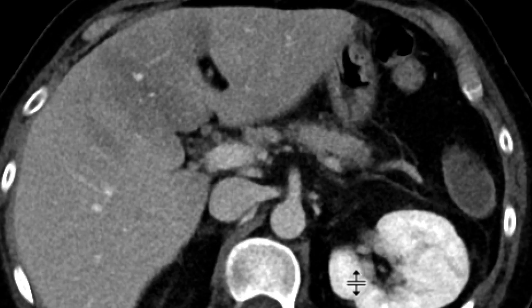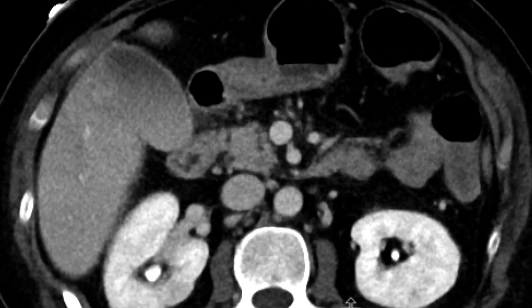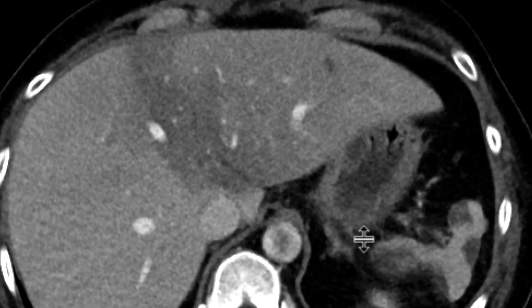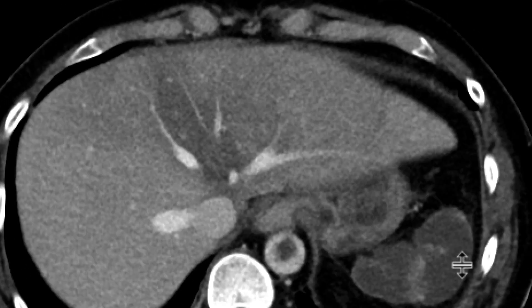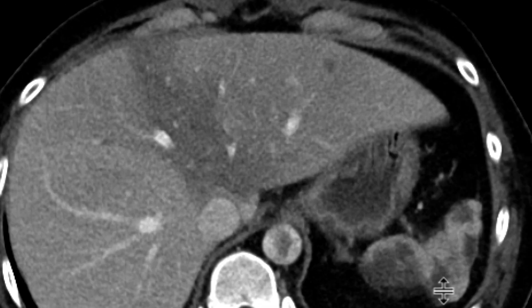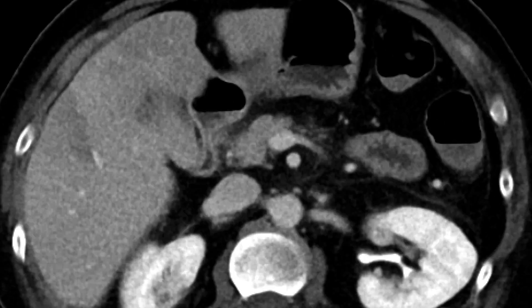We'll scroll down and come back to that in a bit, but the organs here don't look too happy. We can see that the spleen is not enhancing, so there's quite a large splenic infarct.